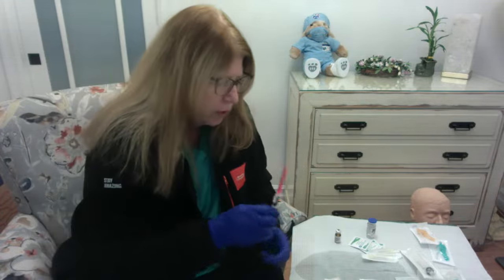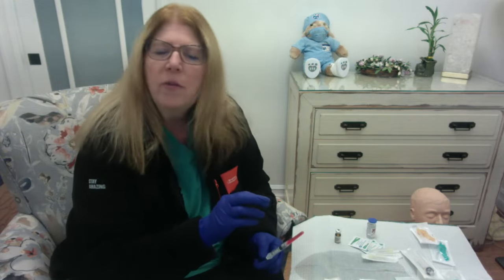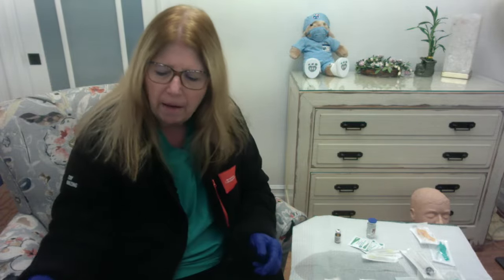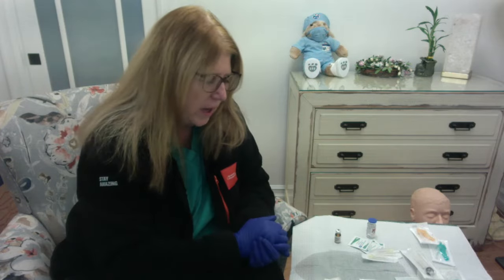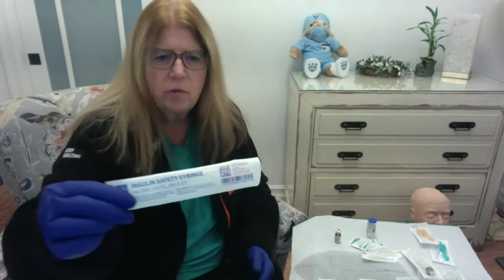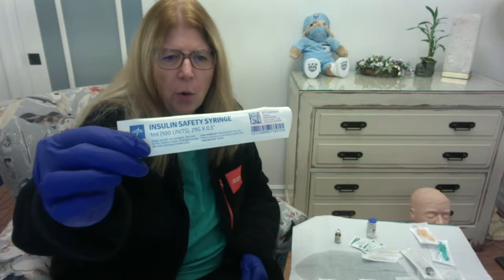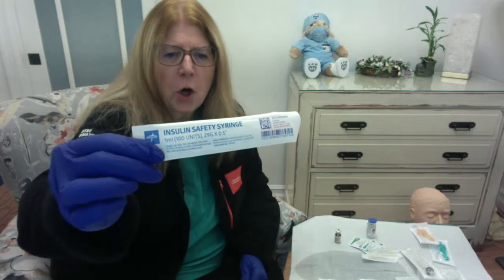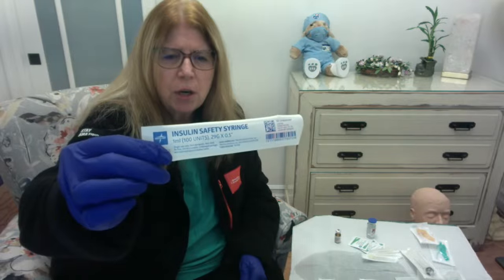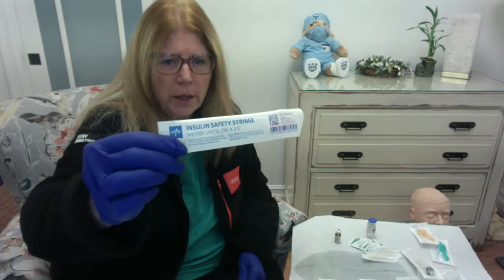Now, these syringes that I showed you initially, the 3 ml and the 10 ml, are referred to as standard syringes. We also have a syringe that is specific for insulin, okay? So this tells you right here, this is an insulin safety syringe. It holds 1 milliliter or 100 units of insulin. This is a 29 gauge needle that is a half inch long. So this is a very small needle.